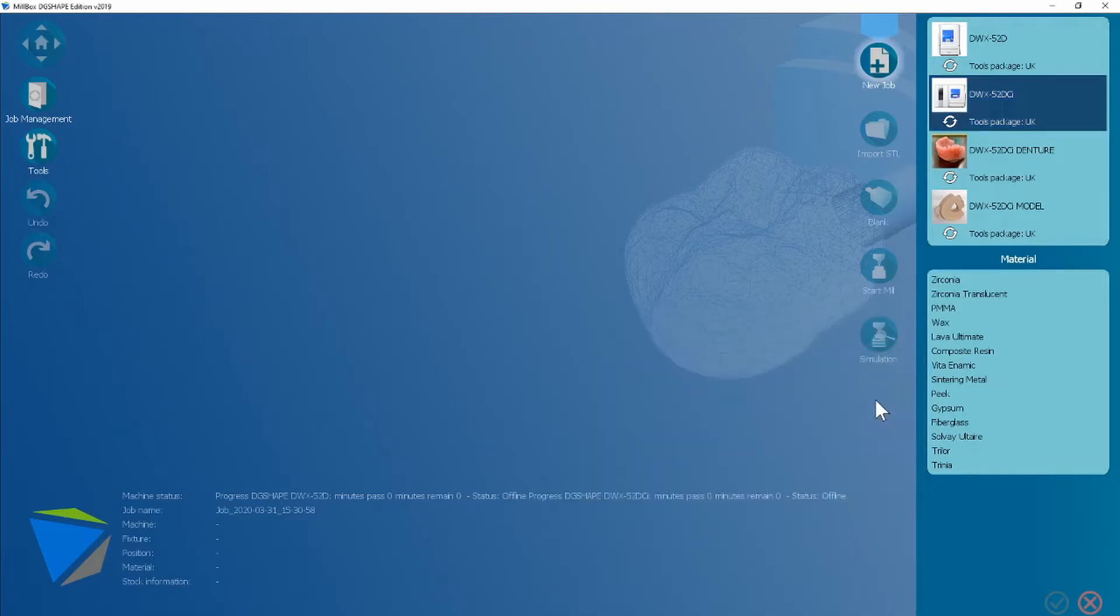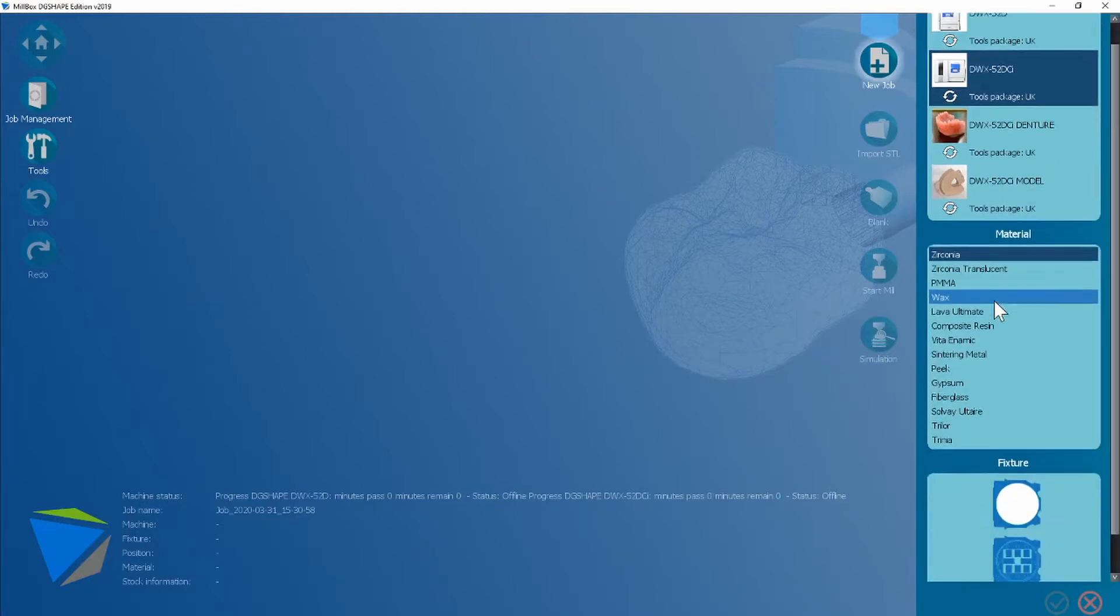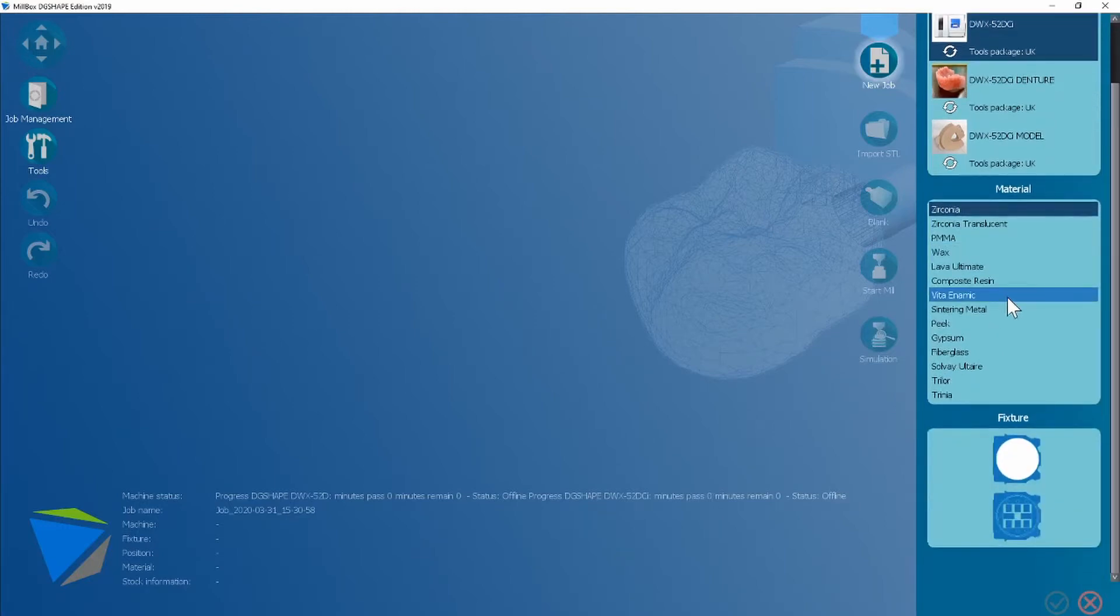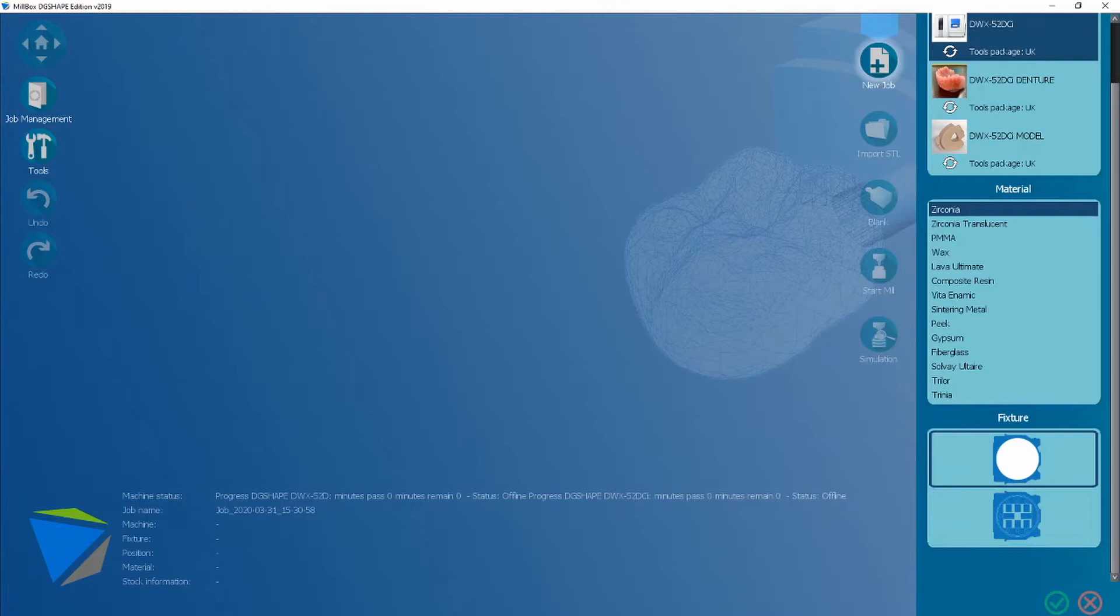Once you're happy you can then choose a material. I'm going to choose zirconia. Then you can move on to selecting a fixture type. I'm going to use a disk but the CAD block option is available and then you click next.